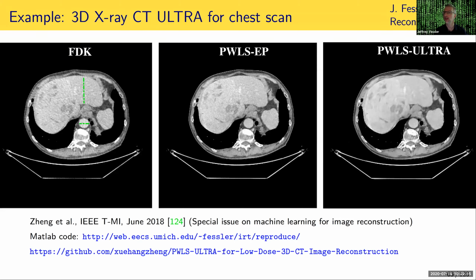I was presenting this once to an NIBIB panel, and somebody was asking about some of these subtle white and dark structures in here, and there was a radiologist in the room who could confirm that he thought that these were real properties of some disorder of the liver or whatever, that he thought he could better see here than in either of these 2 images. But that's an anecdotal, sample size of 1 observation.